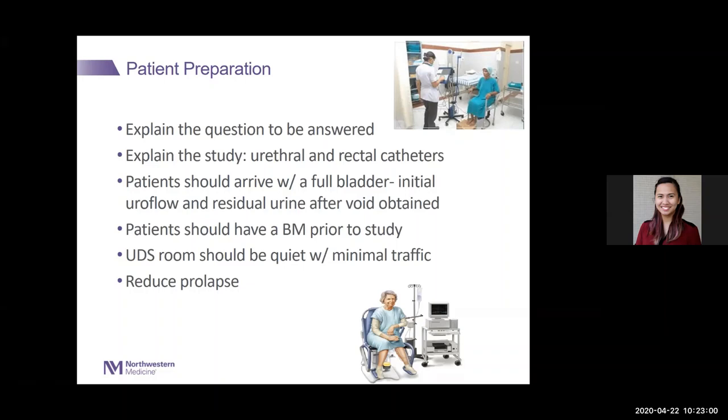For women, if they have prolapse, and we'll talk about this in a little bit, you do want to reduce their prolapse. And we'll talk about why that is in a minute. And you have to give them a nice hat to wear and a gown. No, I'm kidding. All right.